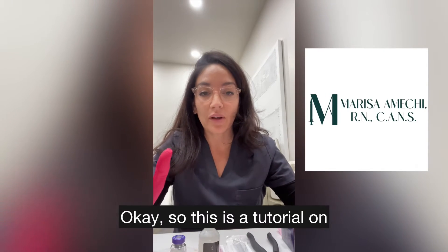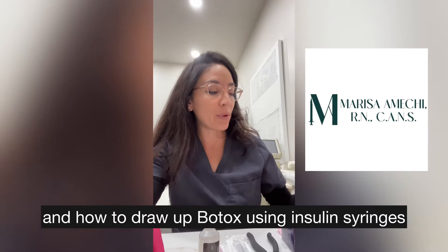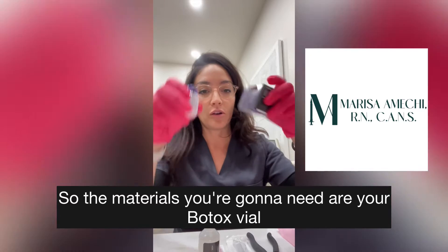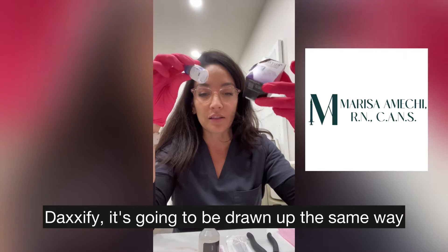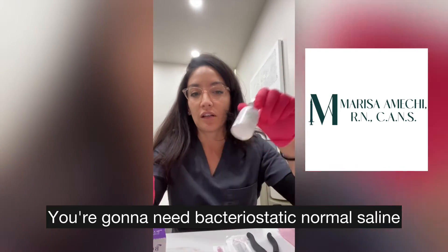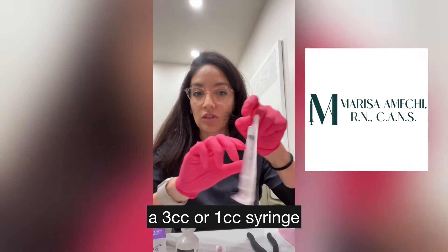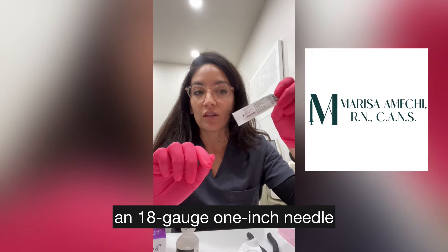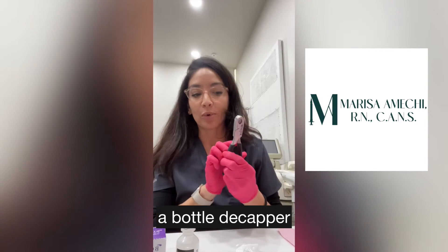This is a tutorial on how to mix Botox vials and how to draw up Botox using insulin syringes. The materials you're going to need are your Botox vial — you can use Xeomin, Jovo, or Doxify, it's going to be drawn up the same way. I'm using a 100-unit vial of Botox. You're going to need bacteriostatic normal saline, a 3cc or 1cc syringe depending on how you're reconstituting, and an 18-gauge 1-inch needle — you can also use a 20-gauge or 22-gauge.